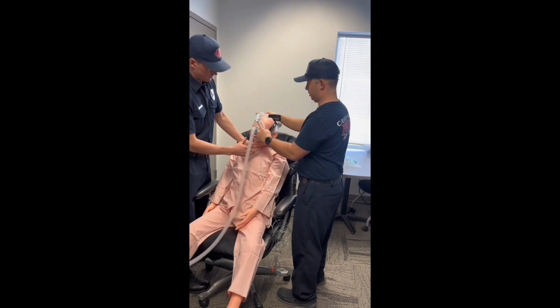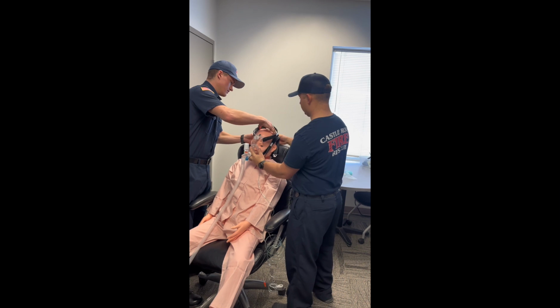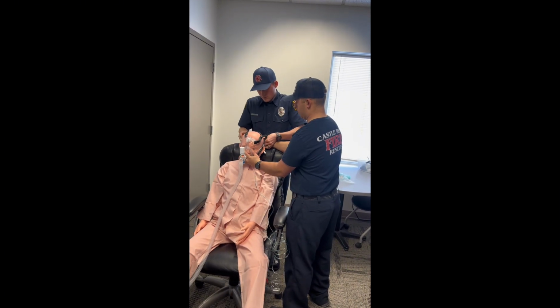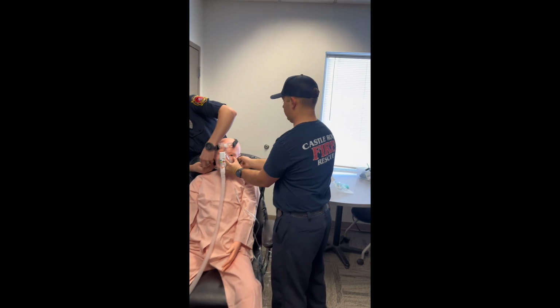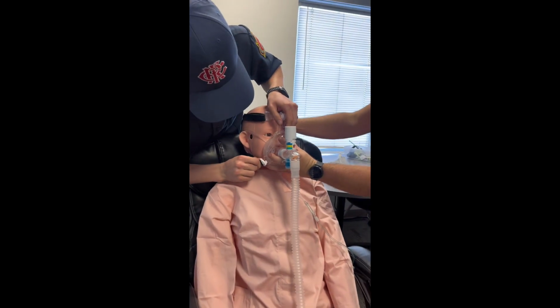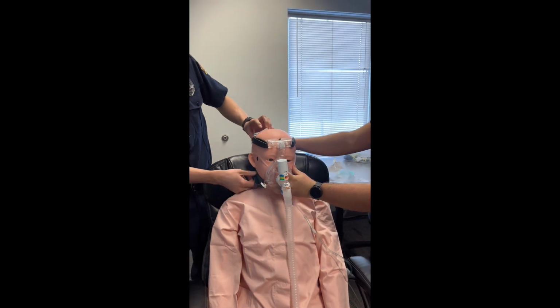EJ is going to hold the mask on the patient, or you can have the patient hold the mask if they're more comfortable with that. And then Colin's going to connect the strap to the CPAP via the white clip, and he can further tighten using the Velcro.